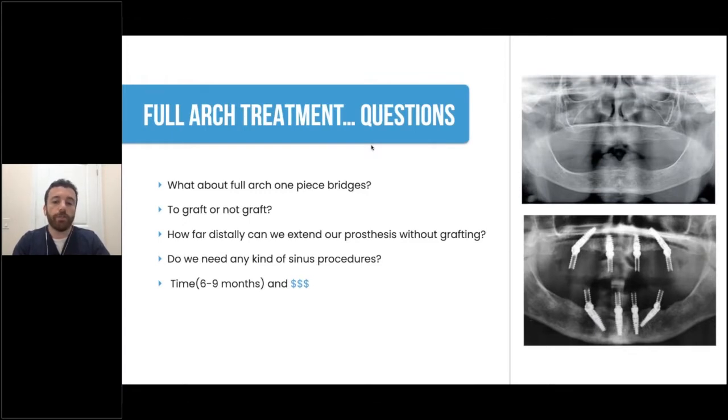one piece bridge solution. Should you graft or not? How far distally can you extend your prosthesis back without grafting? So when we look at All-on-X solutions, we try and minimize the grafting needed for patients. We try and minimize the sinus procedures for patients because those involve extra time and money considerations for these cases.